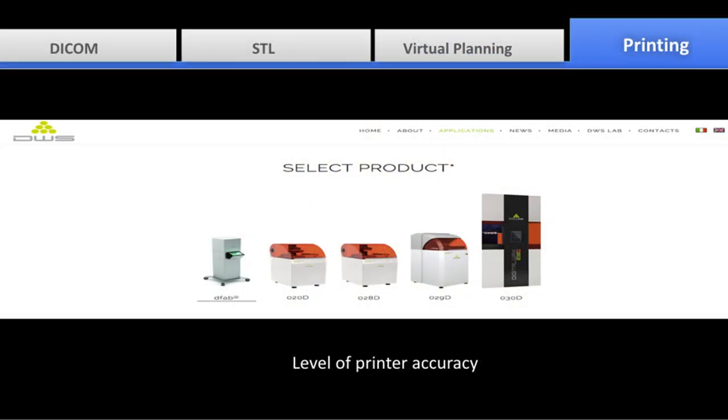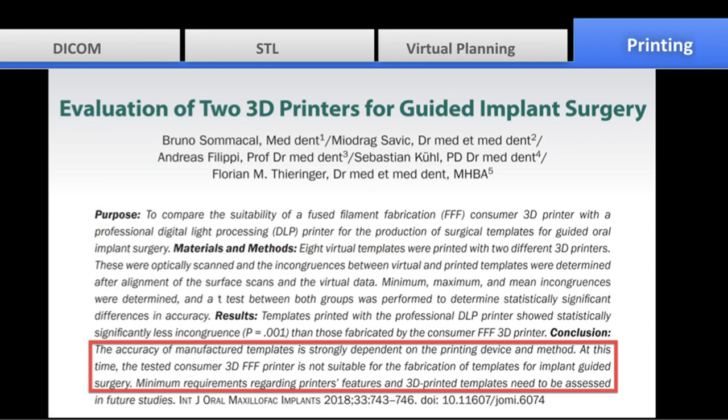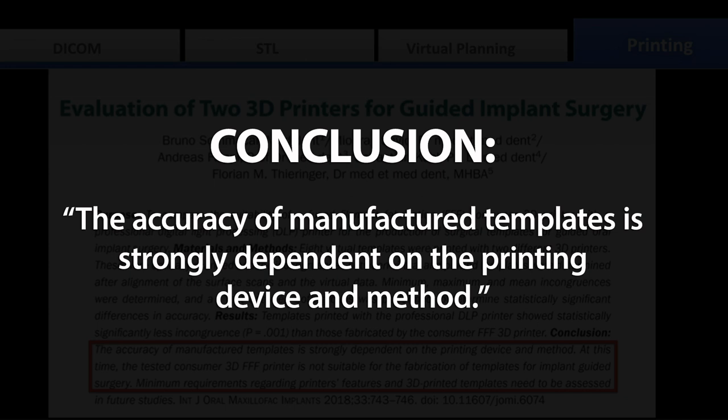In regard to printing, the market involves new printers every day. Still, the accuracy of every printer plays a factor in our final product. And this is a recent article that evaluated two types of printers and concluded that accuracy is device dependent.